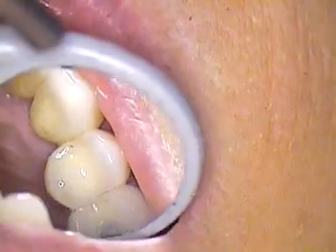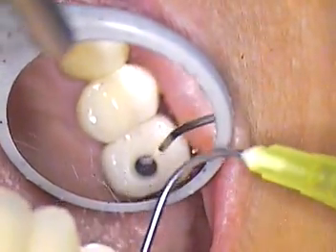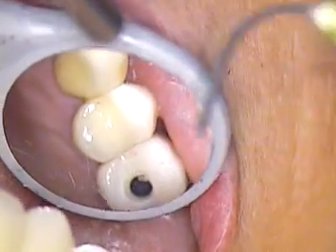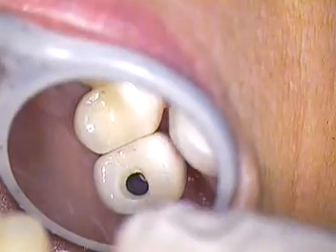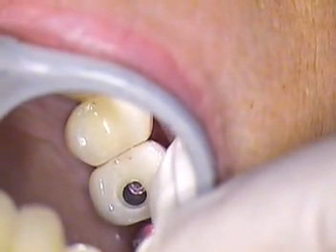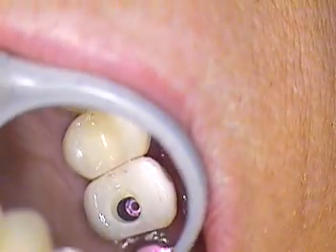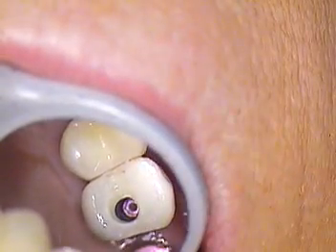I'm here with June's case, and we've already hand tightened the upper right first bicuspid. It is a bone level screw retained single tooth implant crown, and we designed it a little bit further to the distal with the access hole, and much of that came from surgery. So surgery kind of dictated.